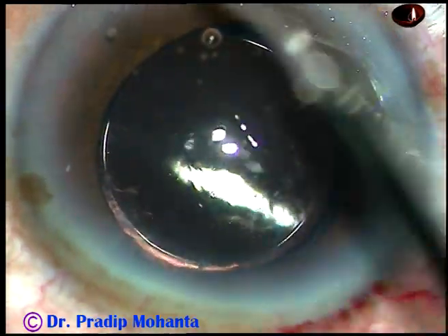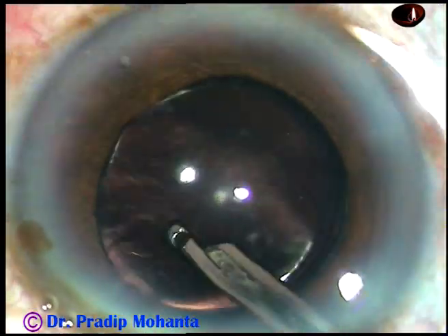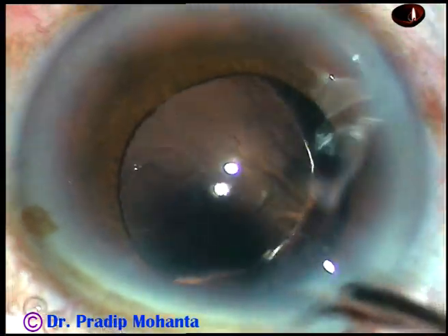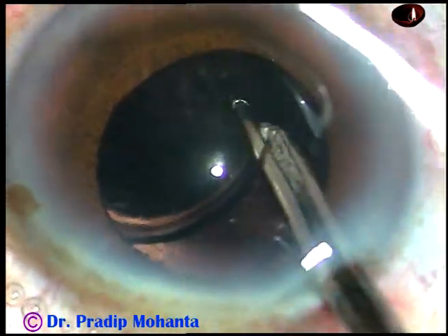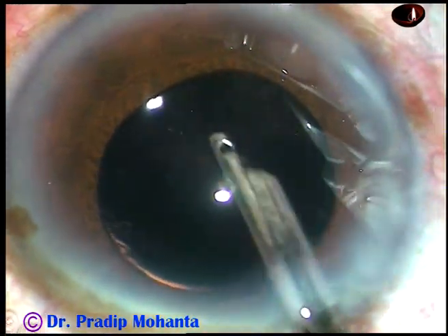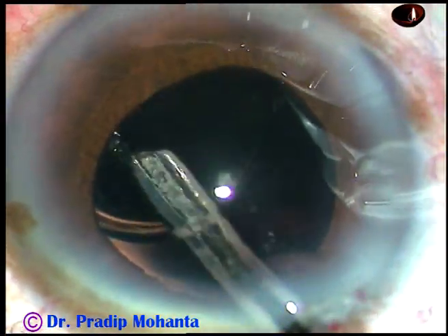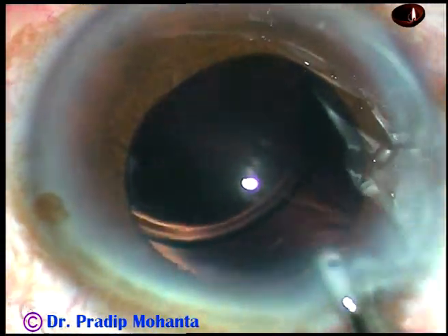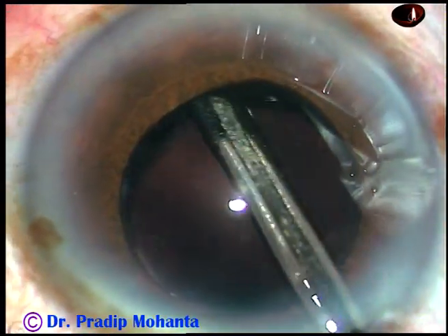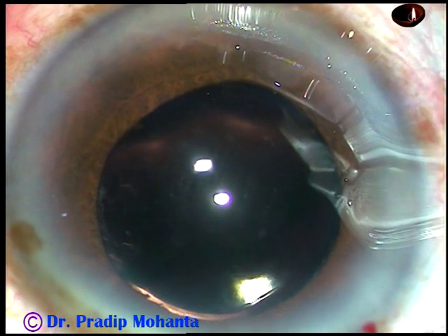Now, the viscoelastic substance is to be cleaned very nicely. I spend a lot of time cleaning the viscoelastic substance. First, I use this instrument — Simcoe 23 gauge — irrigate the anterior chamber for some time. Then I go behind the lens and irrigate the capsular bag. At this time, I can see some cortical matter and I remove that. Here, again at 5 o'clock, I find some cortex — it was removed. The iris became small, so these cortical fibers were hidden by the iris.